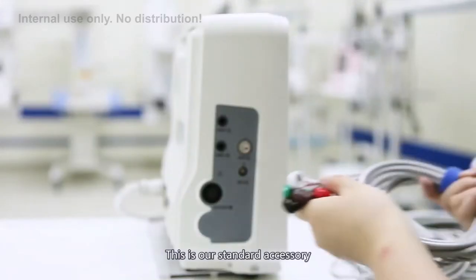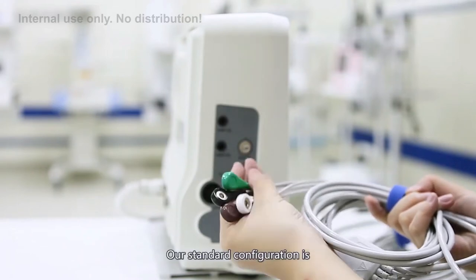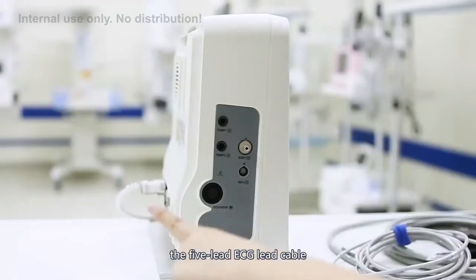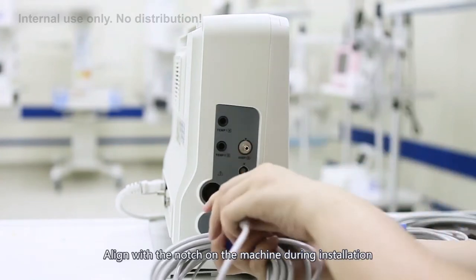Probe installation. These are our standard accessories. The first is the ECG lead cable. Our standard configuration is a 5-lead ECG cable. There is a slot on the connector; align it with the notch on the machine during installation.